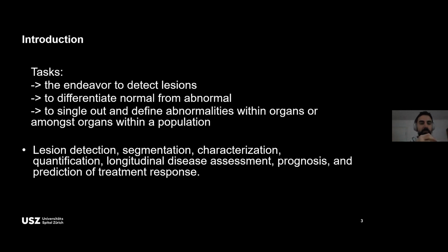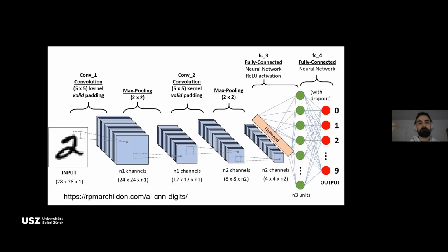Lesion detection is the basic step, and from then on we can make further steps such as lesion segmentation, disease assessment, prognostication, and prediction of treatment response. Just to sum up, a lot has already been said in regard to machine learning and neural networks at this symposium today.